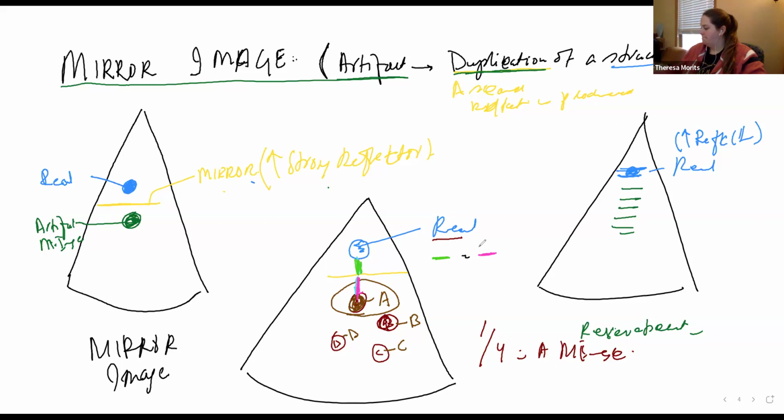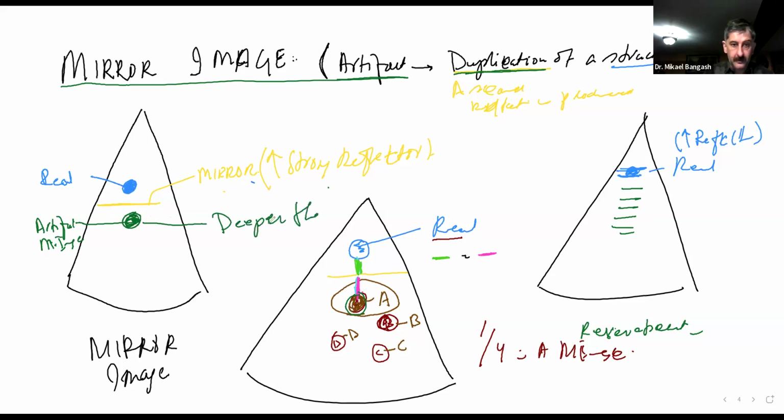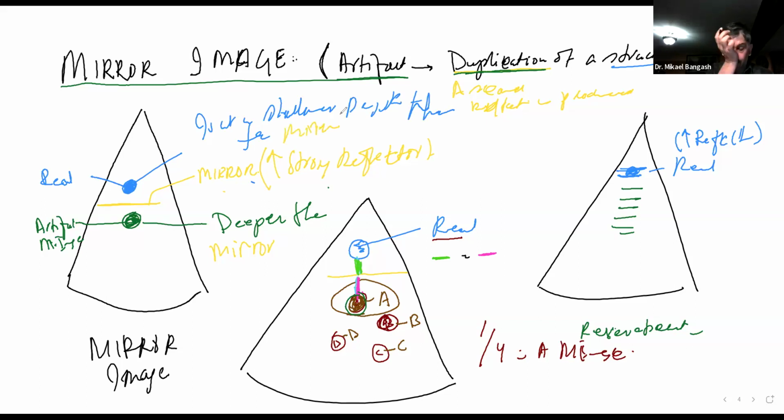Yeah. Okay, but please keep in mind here, guys, that in mirror imaging, the mirror image or the artifact is always going to be deeper than the mirror, whereas the real structure is always going to be at a shallower depth than the mirror.